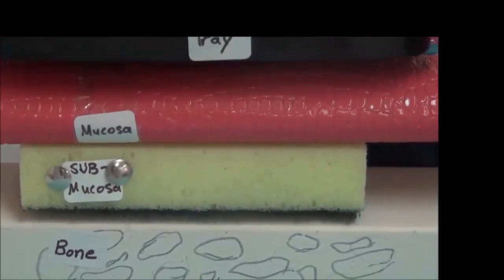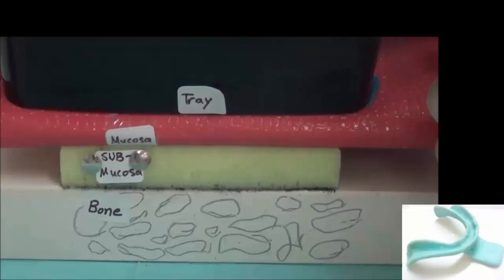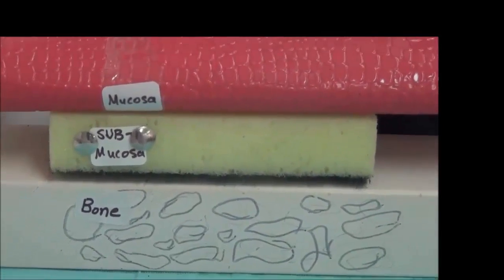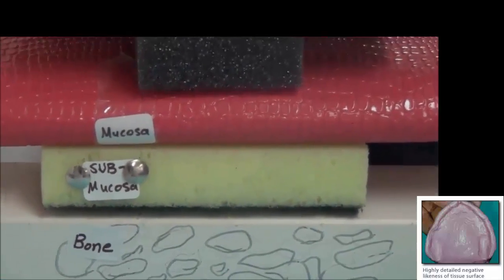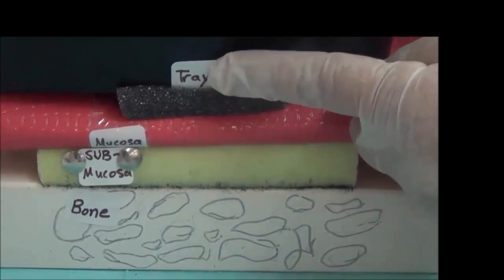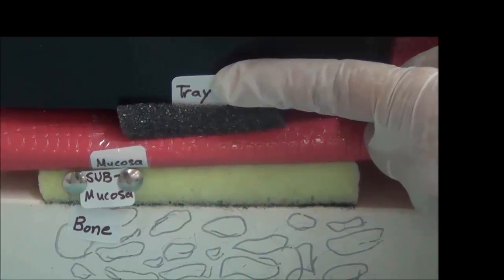and place it over this mucosa and tissue and press without any spacer, that means the tissue will be recorded at this stage, which is the compressed stage. So I'm trying the tray at the beginning like this. Then I place my impression material in between, and then take the tray and squeeze. This means that the impression material is squeezed between the tray and the mucosa and the layers beneath. That means everything is compressed and recorded as such. This is called compressed status.